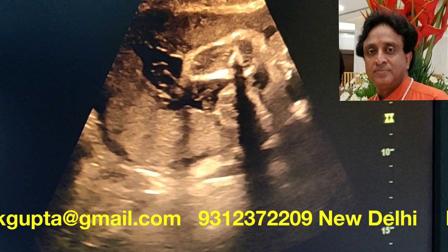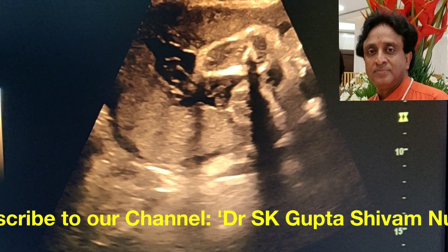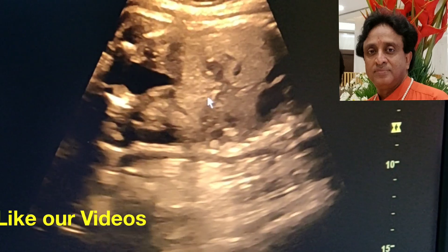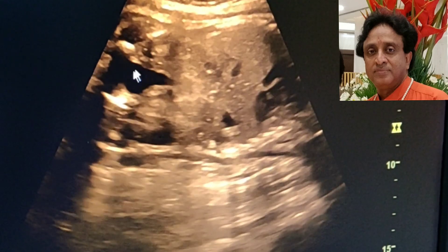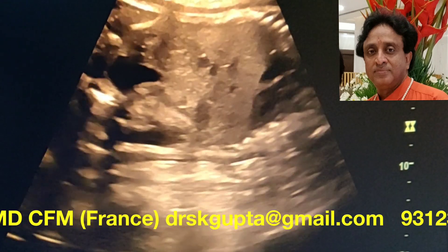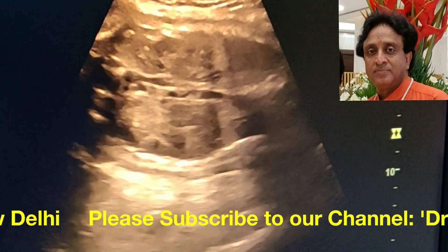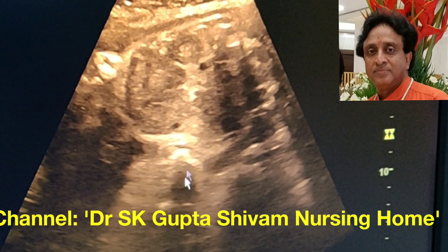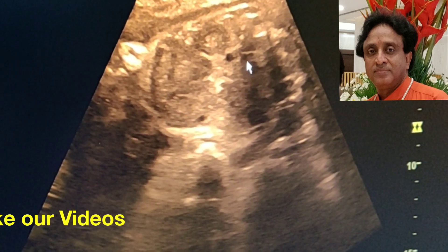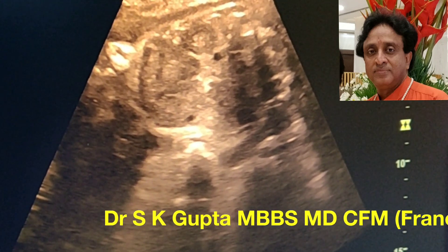It is important to note that hypertension and preeclampsia generally cause oligohydramnios, while maternal diabetes causes polyhydramnios. Here you can see the kidneys and the urinary bladder is well seen, meaning the kidneys are functioning normally. In cross-section both kidneys appear normal, with no hydronephrosis, and the urinary bladder is well filled.